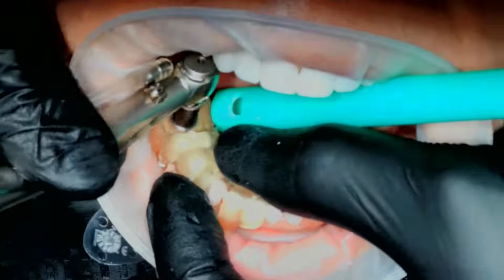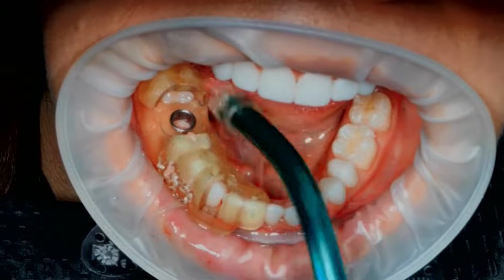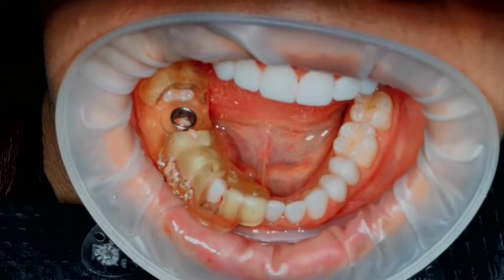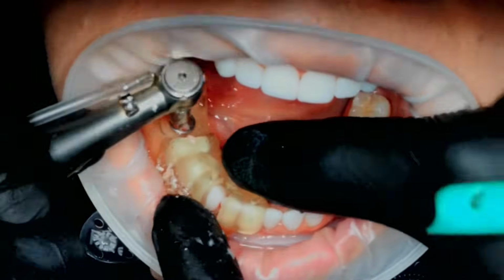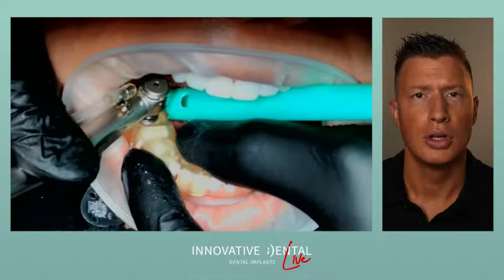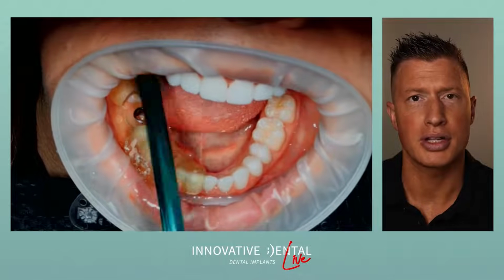And you can see we use plenty of irrigation. The instrumentation we use is all designed specifically for implants. It's sterile water coming right out of sterile bags that we get, so sterile saline. And we're able to use that. And there's the 10 millimeter depth. No pain, very little bleeding. We don't have really much going on here for the patient.